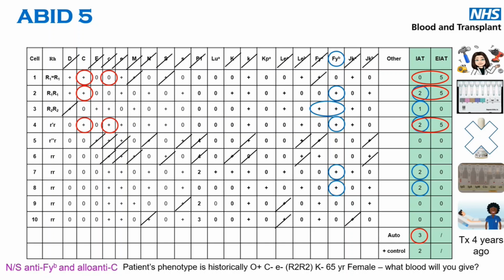So you can't phenotype for the Duffy B because you would get a false positive from the IgG coated red cells on your patient, because you use that bridging antibody, which will just bind anti-IgG. It'll bind IgG and it'll give you a false positive. So you can't determine what the Duffy B is going to be. But you can type the big C because that's an IgM reagent. So that's that understanding of what's going on.